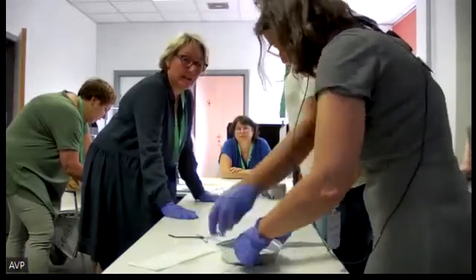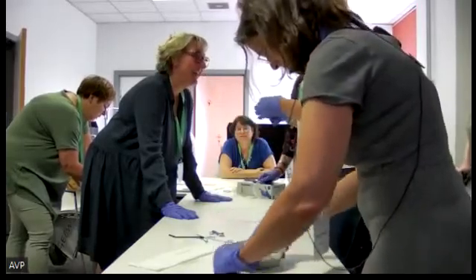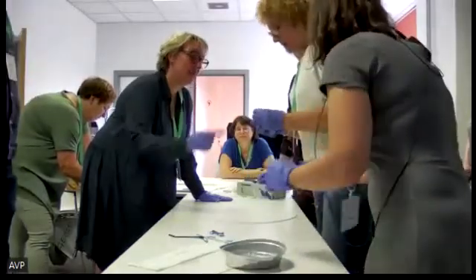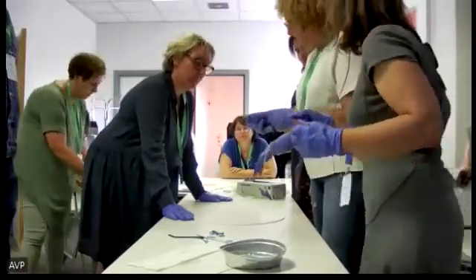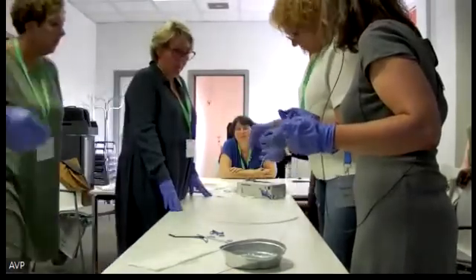Always work with the guideline. Okay, you go here. Go out. Pour les 2 premières, it's 2 centimeters. Just the black marker, radio marker. The second nurse is taking the wire.